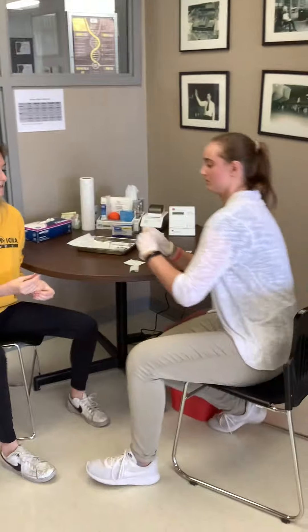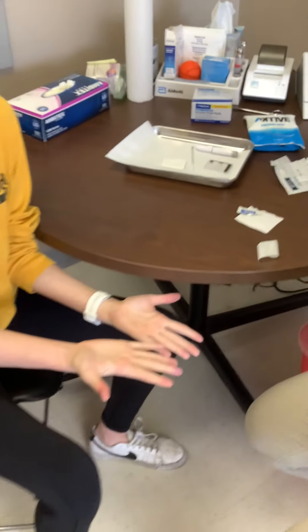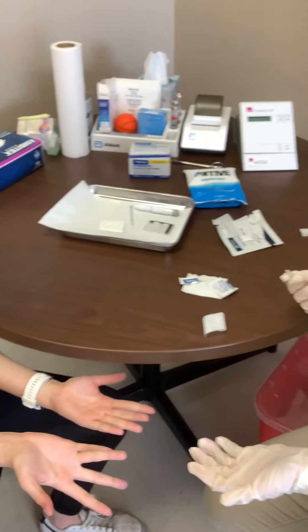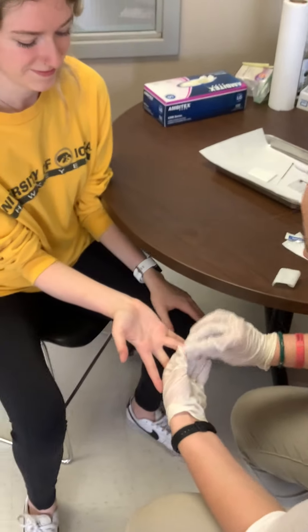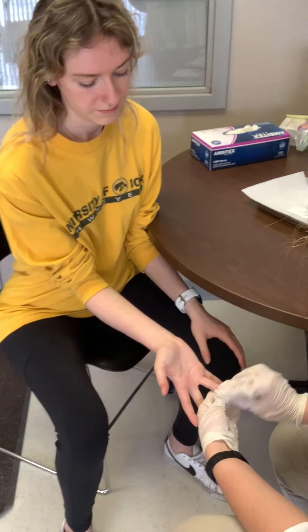I like to sit down too. They can choose either their ring finger or their middle finger, whichever hand they please. Don't be afraid to let gravity help — keep that hand a little bit lower than the heart.